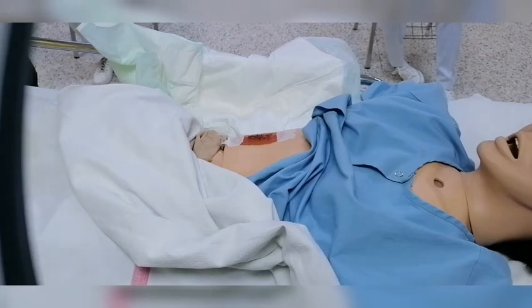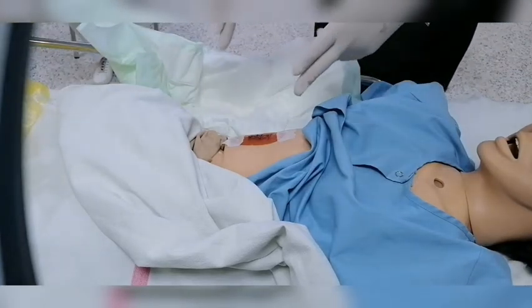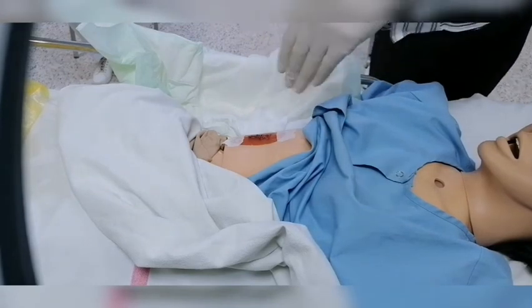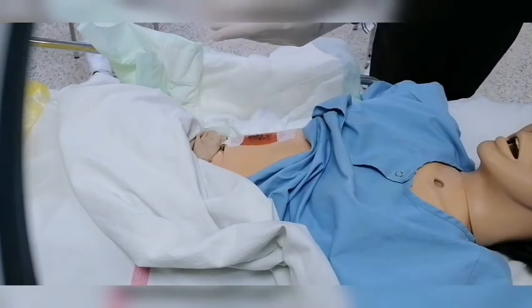So those contaminated equipment or disposable things, I have to throw in a yellow bag to be incinerated there. Then I have to check the wound itself. What type of wound is it? Is there any secretion? If secretion is there, what type of secretion? What's the color of it?